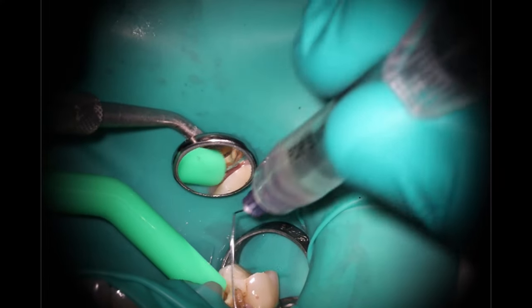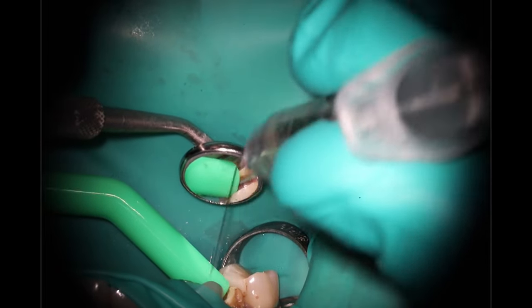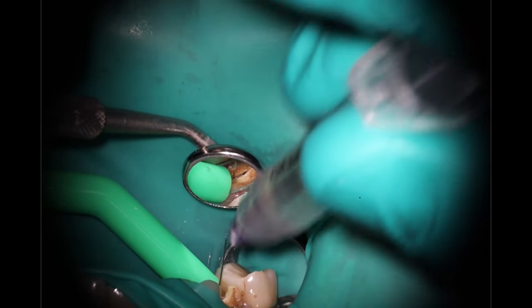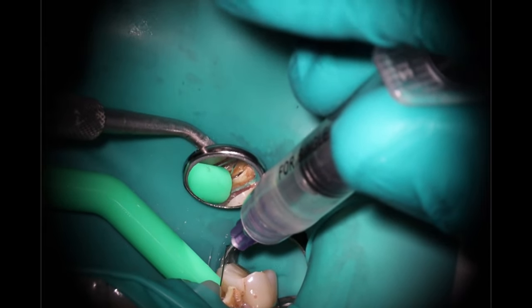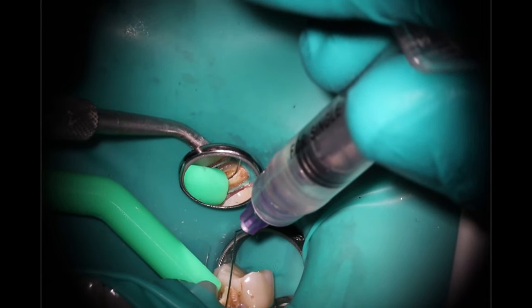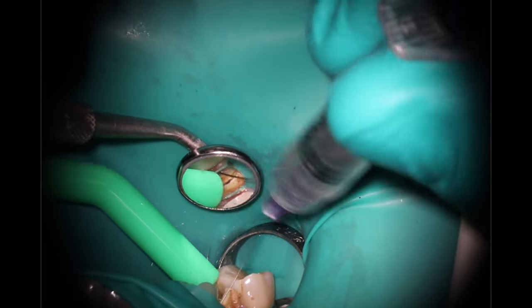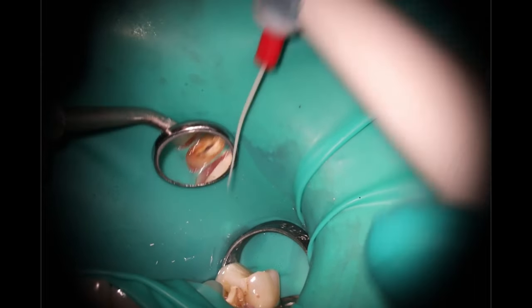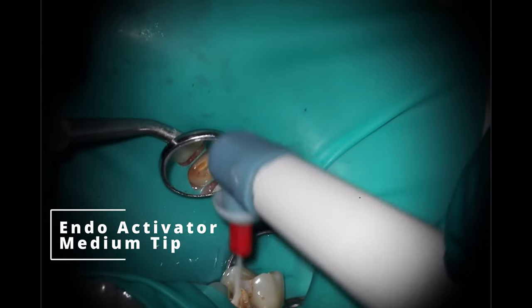Going with our final rinse — I still like that Triton stuff from Brasseler; it just seems to do a good job bubbling up and getting all the nastiness out of there. What I'm really looking for is how much debris we have coming out, whether I'm still seeing any bleeding or drainage. For a case like this that was vital, it's really not too hard to get it cleaned out efficiently.